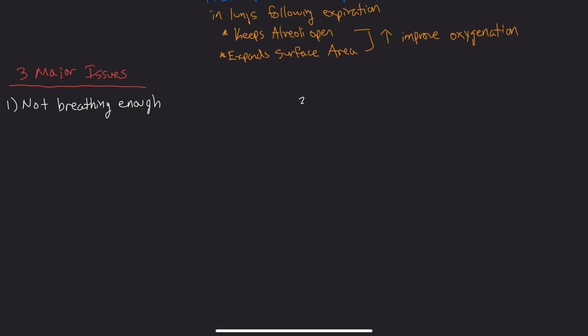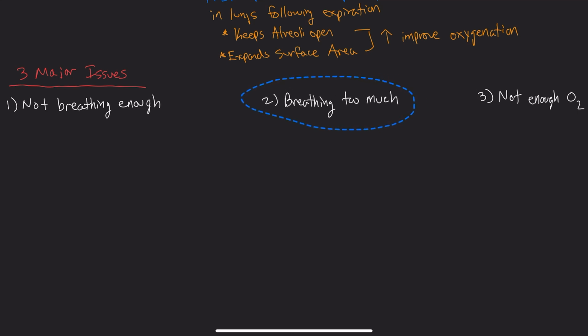Number 2 is going to be the opposite. Patient is breathing too much. And third will be that the patient does not have enough O2. Not enough O2.